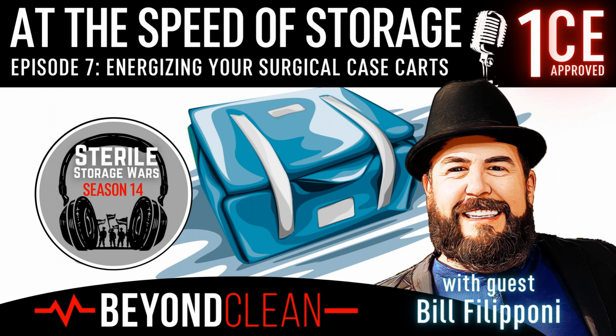Do you do it in your facility? Have you been in facilities that do it? It's like, why not? So, I think, when you look at a crash cart or a code cart, we lock those, right? Why? Because we don't want an emergency. We don't want that to have to happen. I think that having the ability to lock a cart with a breakable lock is a great idea.